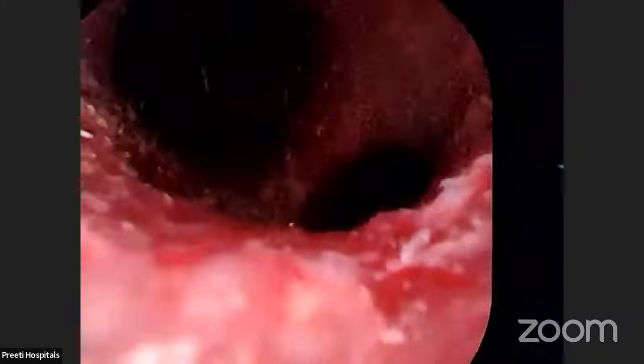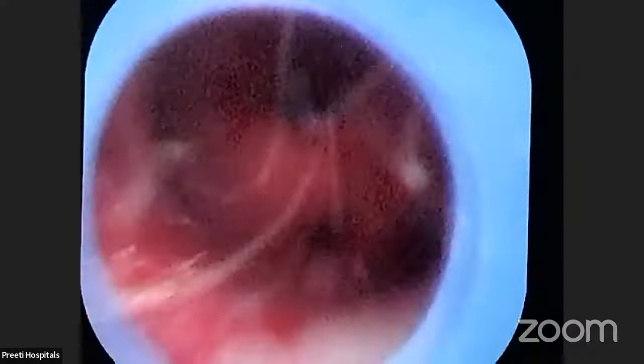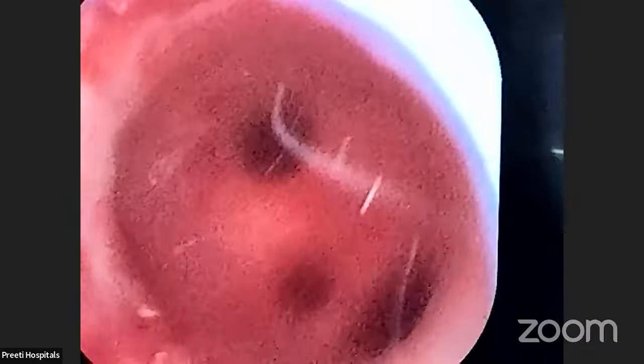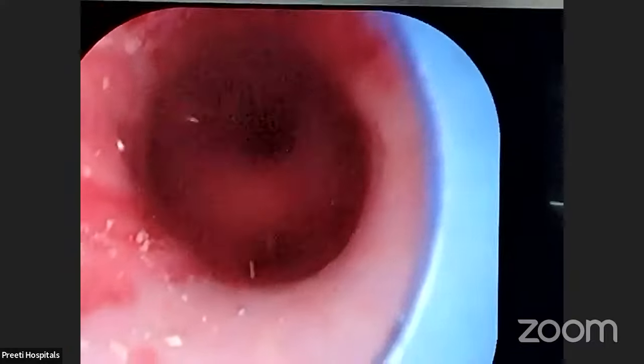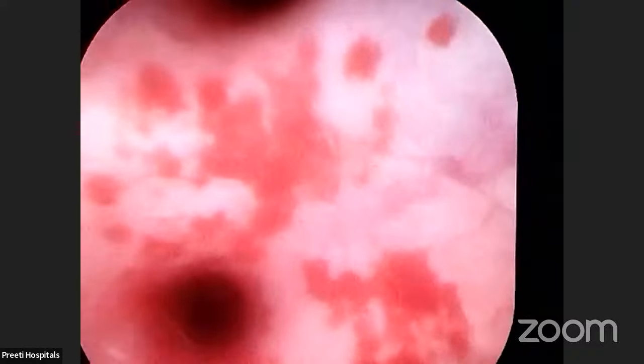Now, ultras ready. See the PUJ? Have you observed the PUJ, Karthik? Yes, sir. So what will happen to the PUJ? Nothing. See, the entire PUJ we are showing like the infundibulum, entire PUJ and ureter. Capillaries are seen. Can you see the capillaries? Yes, sir. Only erythema is there because of the stent, everything.